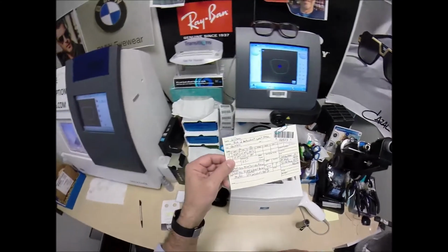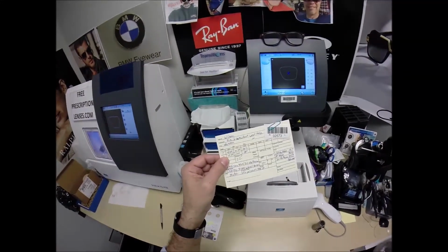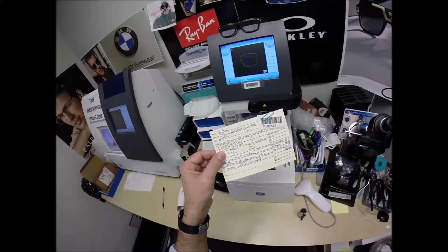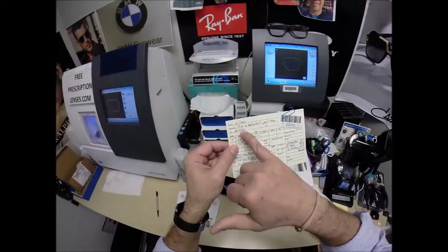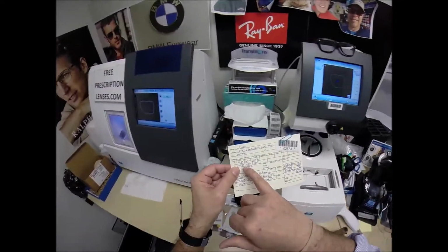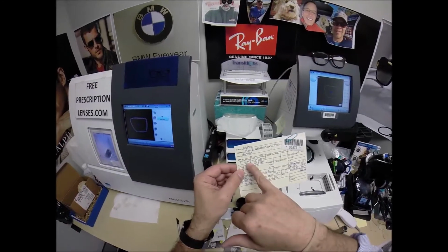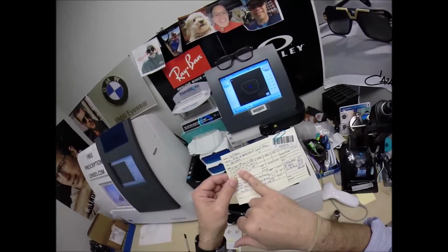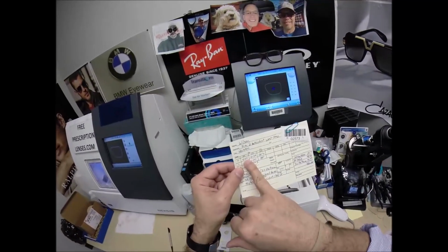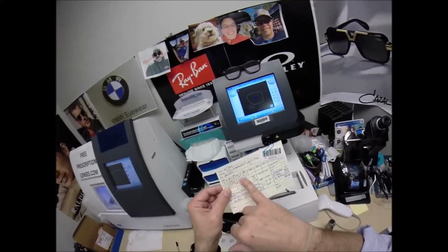The unit of measurement we use in the optical world is called a diopter, spelled D-I-O-P-T-E-R. It starts at 0, which we in the optical industry call Plano. In Texas, they call that a city. That's right, Houston, you call Plano a city. But it goes in quarter increments, 0.25, 0.50, 0.75, 1. You're on the first rung of a ladder. You have the smallest amount of nearsighted correction you can have, so you now have the smallest amount of correction that you can get in a prescription, -1/4.